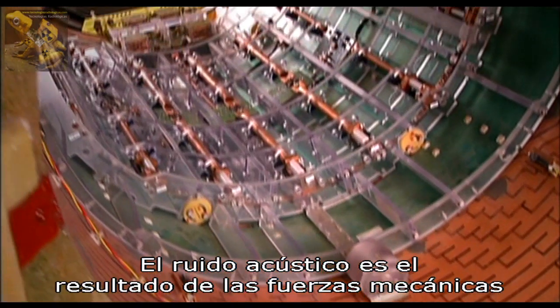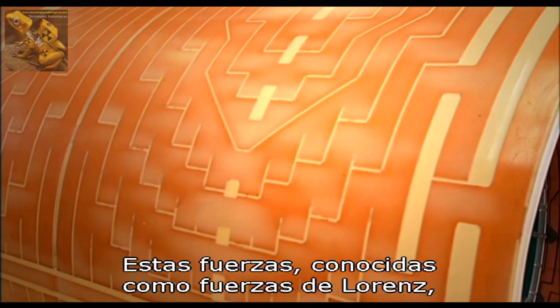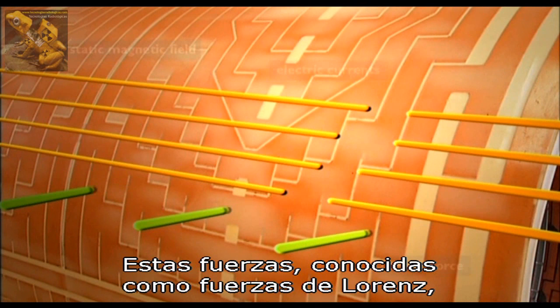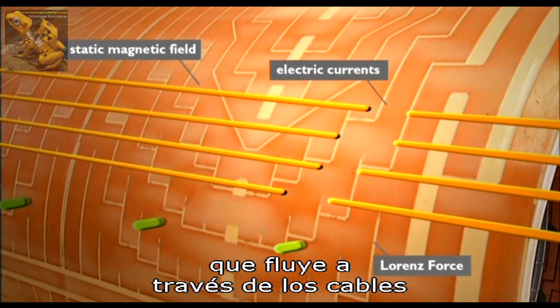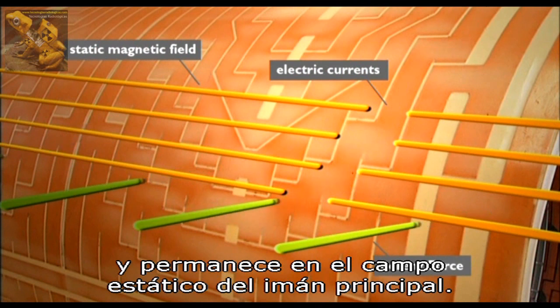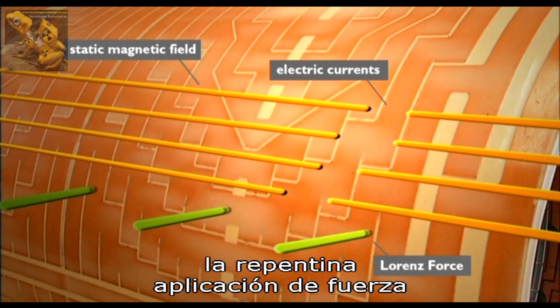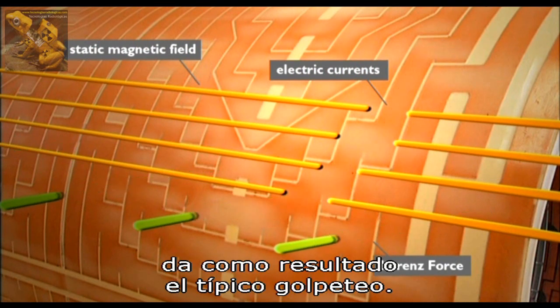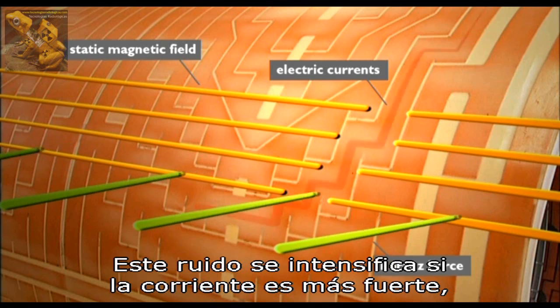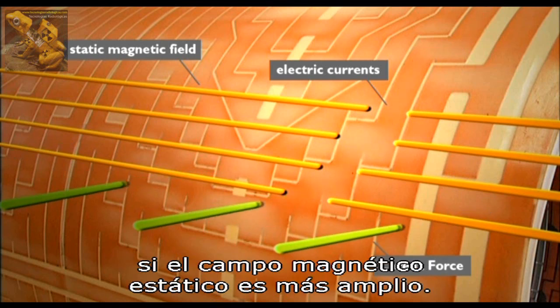The acoustic noise results from mechanical forces on the gradient copper leads. These forces, known as Lorentz forces, are due to high electric currents applied through the copper leads, which lie within the static field of the main magnet. Since the copper leads are not free to move, the sudden application of force results in the typical knocking sound of the system. This sound becomes louder with higher currents, shorter switching times, and a higher static magnetic field.